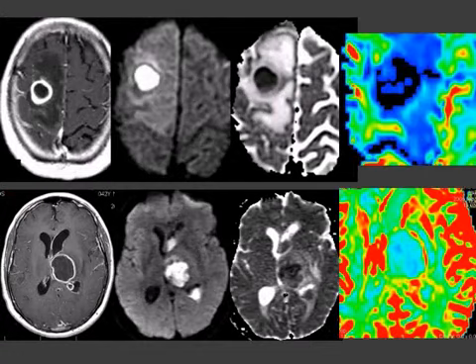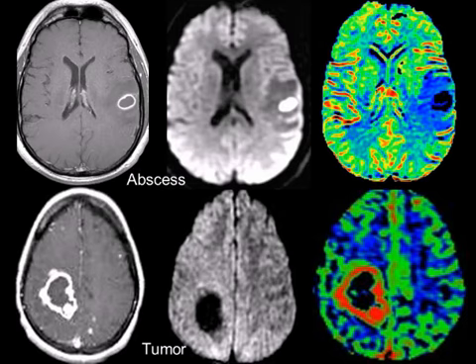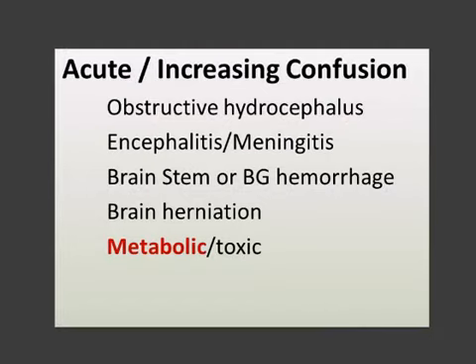If you really like neuroradiology and all these long protocols, you might add perfusion, which will be negative or show a very tiny capsule, and then you will have even more security. What are you talking about? Abscess with bright diffusion and low perfusion; tumor with low diffusion and a high perfusion in a tumor part.